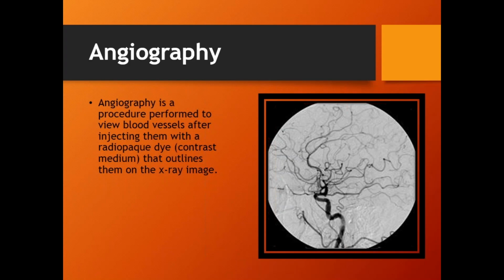But angiography is a procedure. Angiography is a procedure performed to view blood vessels after injecting them with the radiopaque dye or the contrast fluid that outlines them on the X-ray image, which makes the viewing of these blood vessels even possible.